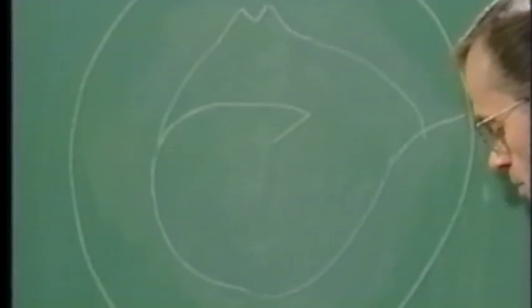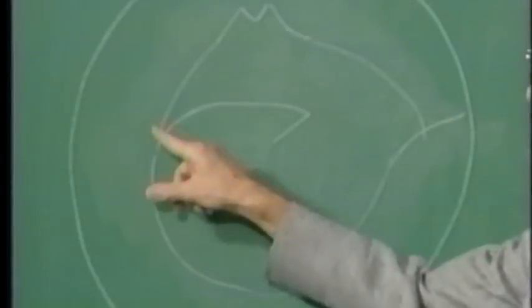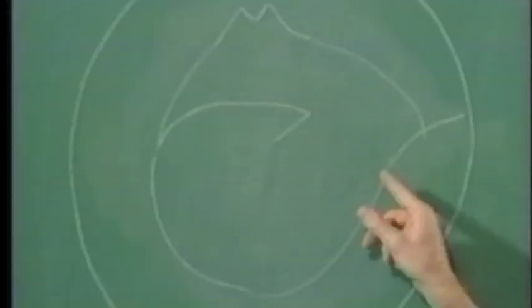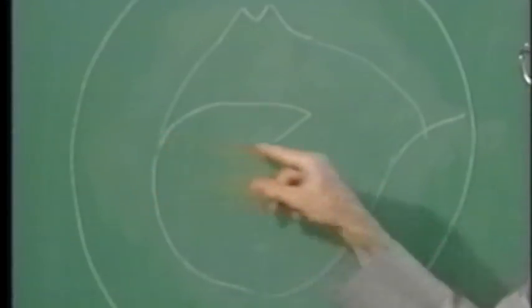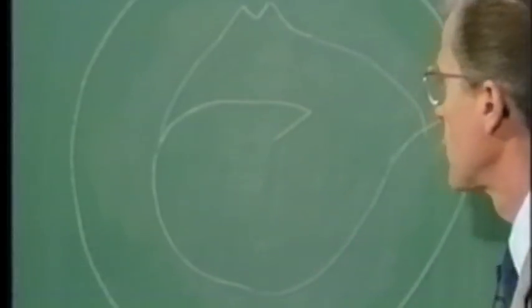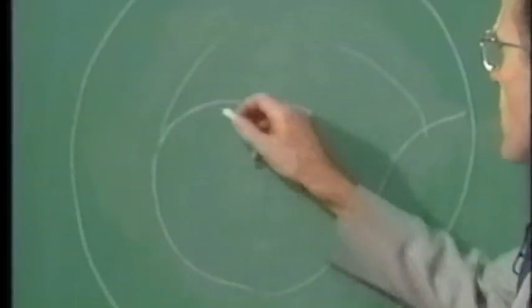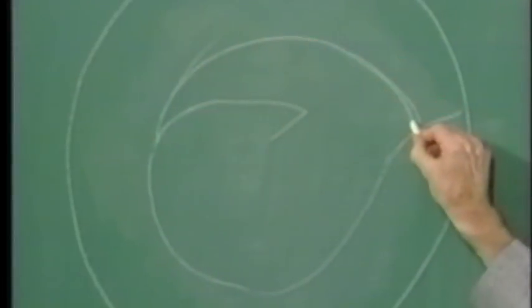So there are a number of different ways to complete it, but I think the safest one is to use the Vanna Scissor to make a tangential snip on one side or the other. And I would choose this left hand side so as not to put any extra tension on this one tear. And then one ends up with a continuous curvilinear capsulorhexis with one defect.